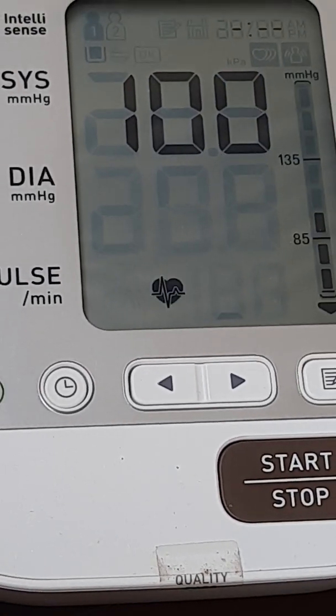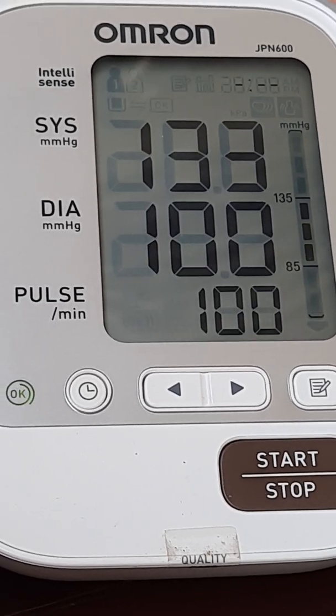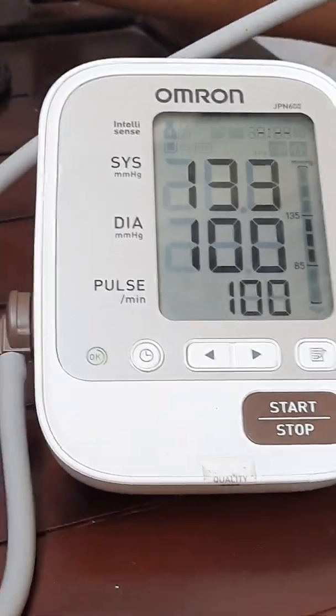And the result is one hundred and thirty-three over one hundred.